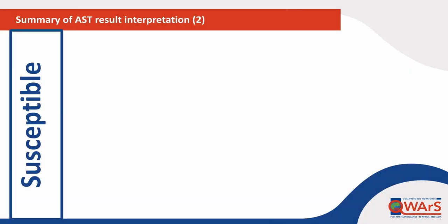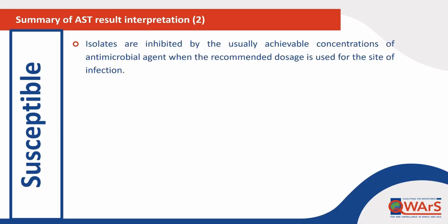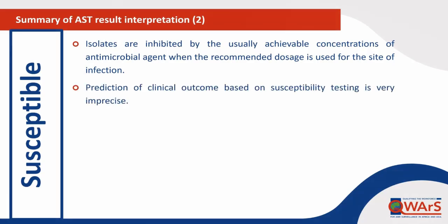According to the CLSI, the susceptible category implies that isolates are inhibited by the antimicrobial agent when the recommended dose is used. Note that this definition says nothing about the chances of clinical success.